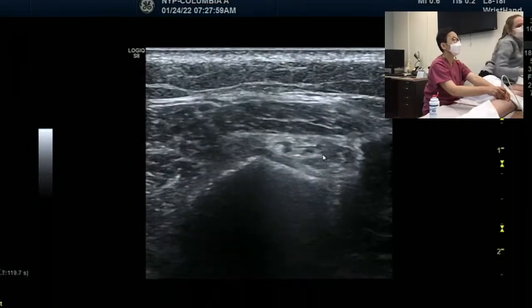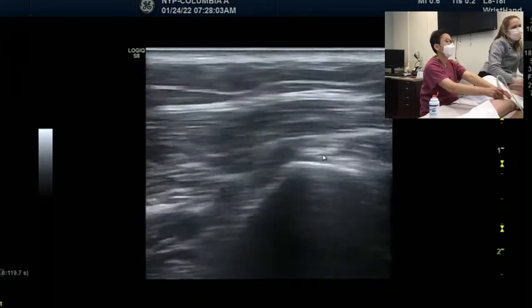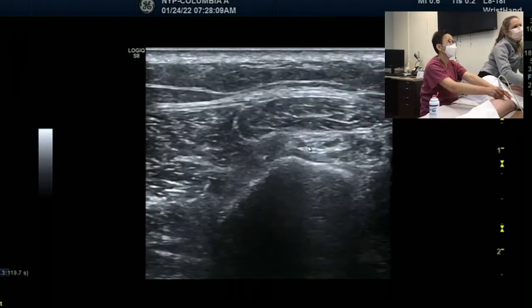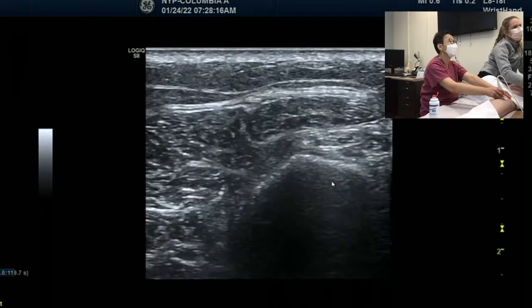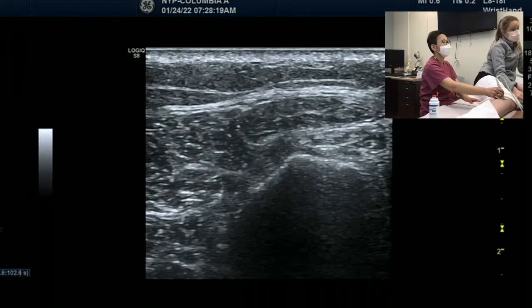It makes sense because it's just below the fibula head. Do you guys see? Just below the fibula head, a honeycomb shape, but it looks like two branches. You see one, oh, it's splitting here, one, two. Oh, good. Let's freeze, and then you can explain what is one and two.